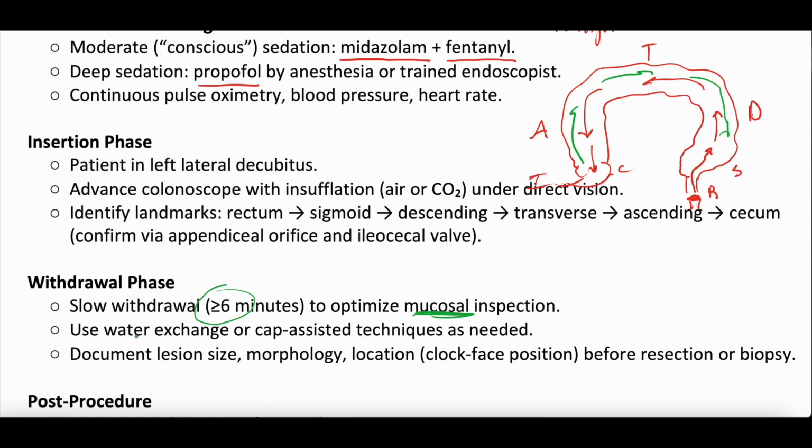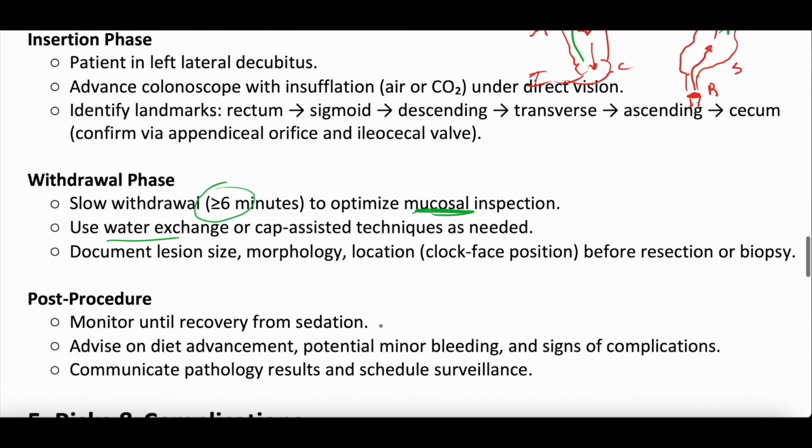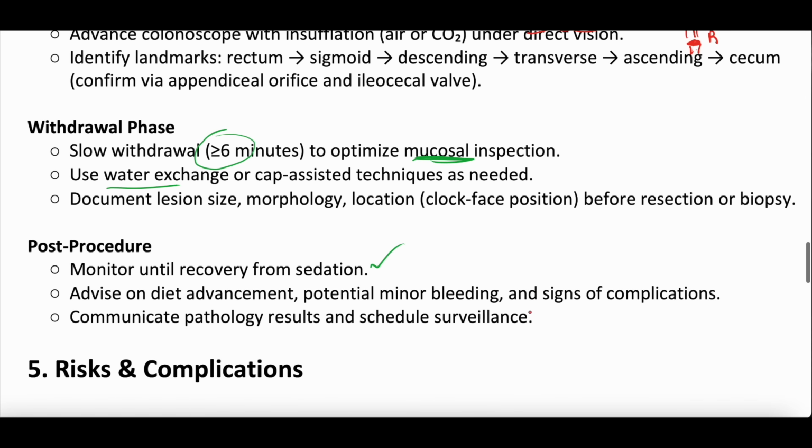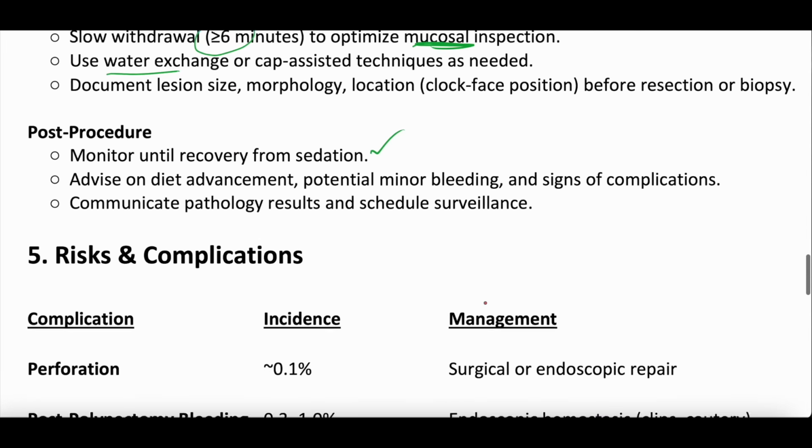And the colonoscope has kind of this water mechanism to clean walls so they can see things well, and they're really looking to make sure they're documenting and getting every single lesion that they might see. Post-procedure is mostly recovering from the sedation rather than the procedure itself. Most patients are able to kind of advance diet and all that, depending on what they had done. And then the pathology, if they had to take a lesion off, takes a couple days.